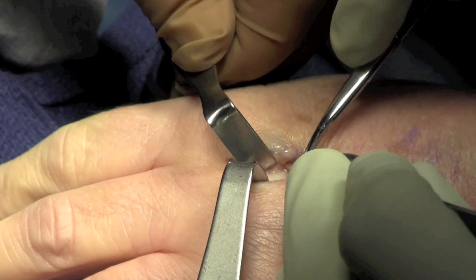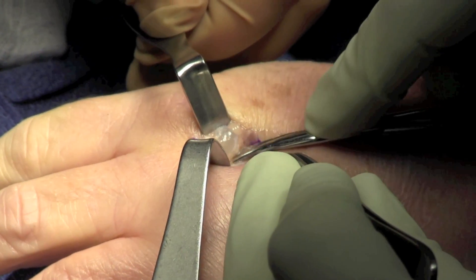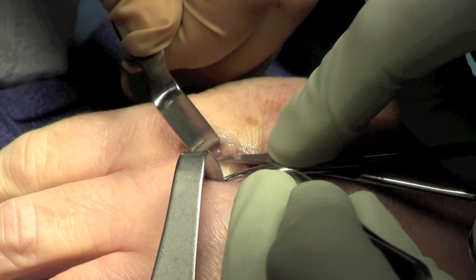The tendon is identified and carefully protected, as is the distal juncture. The mass is visualized and dissected off the tendon.